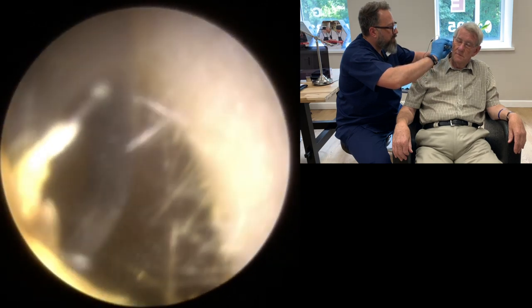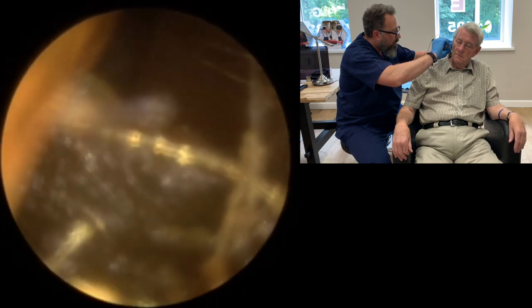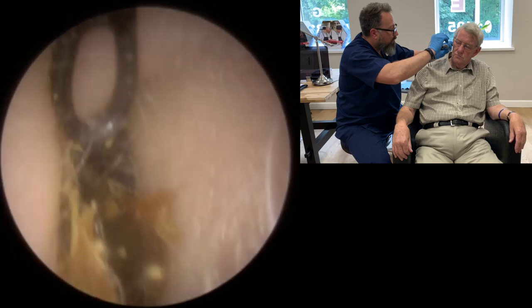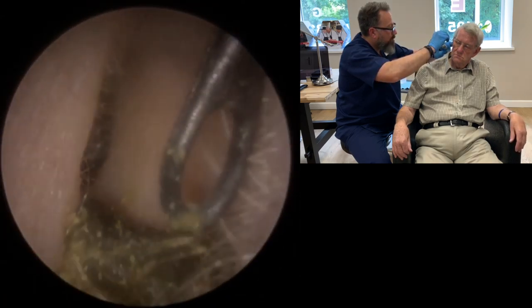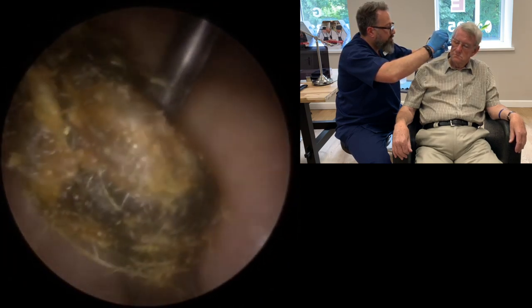So we're just going to try and get behind this sticky wax, over the top, there you go, pull it forwards. Just very slowly work this out. There we are, it's just starting to pop out of the ear now. So we're going behind it again, bringing the next section forwards. There we go. So we've got a nice sticky plug there.